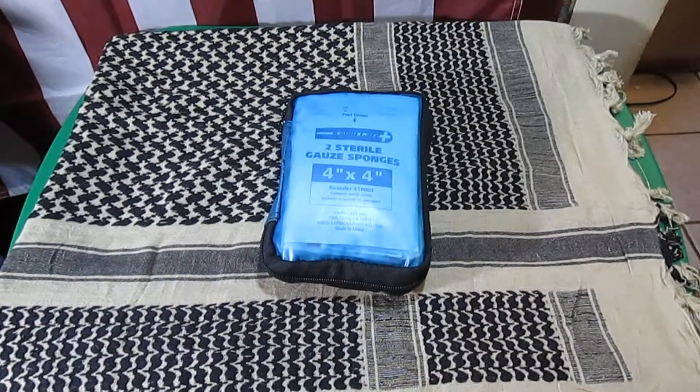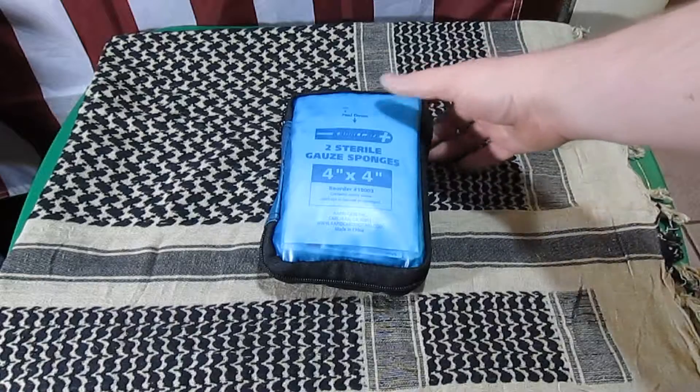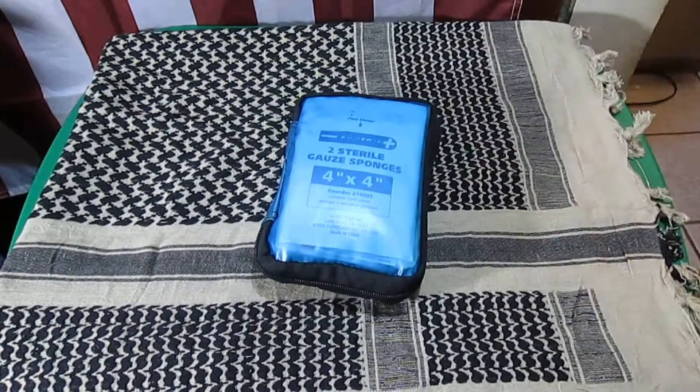Hey everybody, I've got another first aid kit I wanted to share with you. This time it's from ApertCare, it's the 67-piece first aid kit.